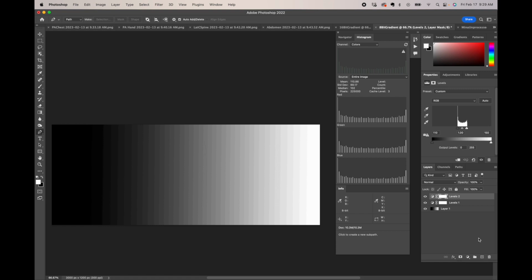And this also comes into play, like I was saying, with the time it takes for the machine to process it, but also the time it takes to send the files over the network. At my clinical site, just last week, we were trying to send the file, and it was clogging up and taking a while, and I didn't even think to mention to the tech, hey, shut down the computer and restart it.